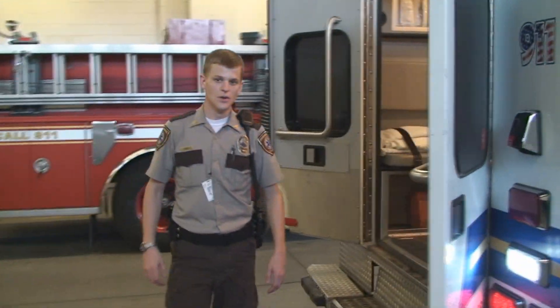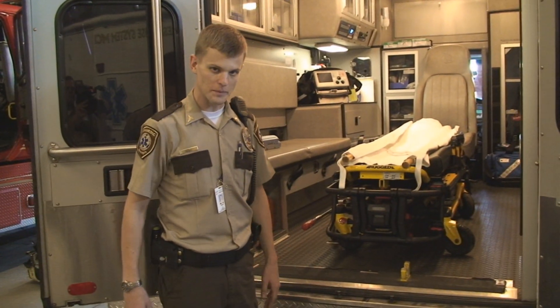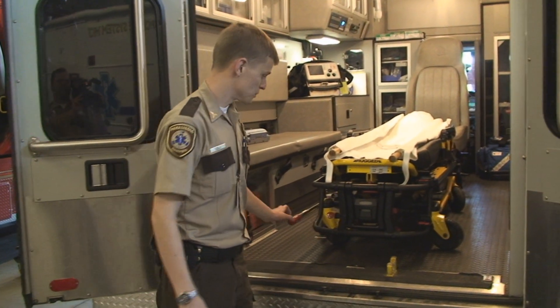Coming to the back side of our ambulance here, we have our ambulance stretcher which we use to put patients on. All of our stretchers here are electric powered and they can lift 700 pounds with just the push of a button.